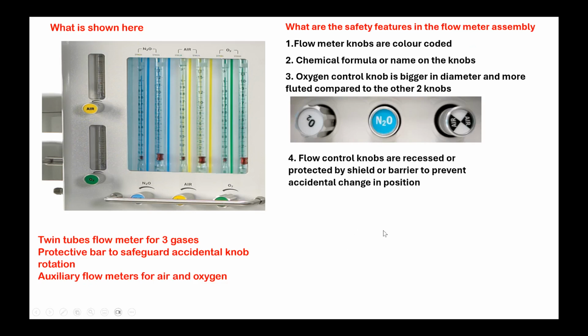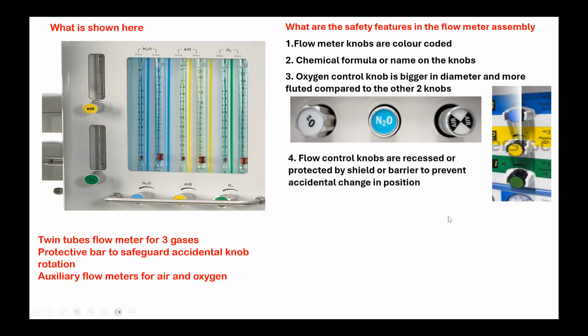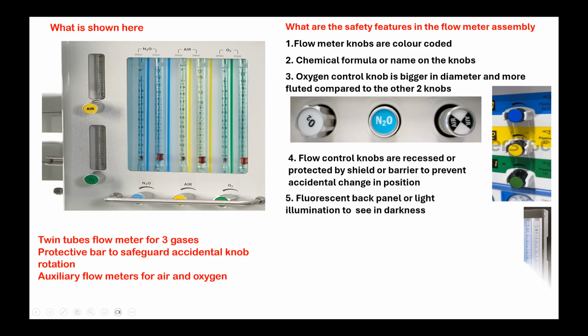And flow control knobs are recessed or protected by shield like this. Okay, it can have side protection also. It need not be always a metal frame like this. It can be side protection. And fluorescent back panel is there in some of the machines.